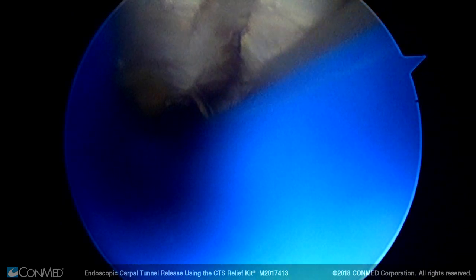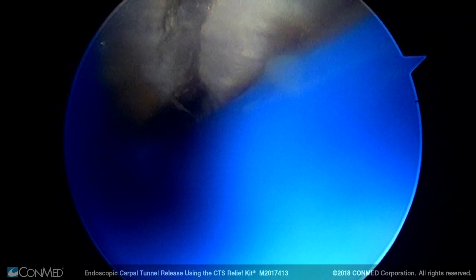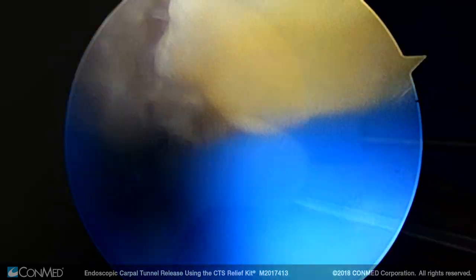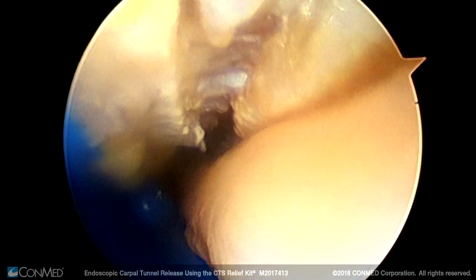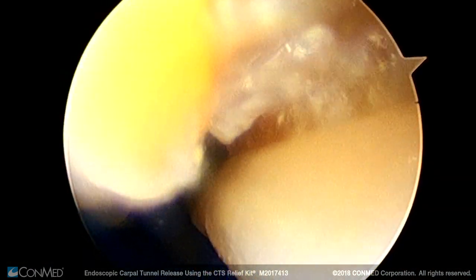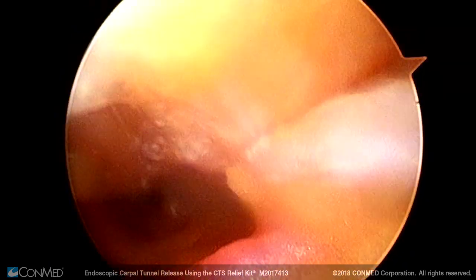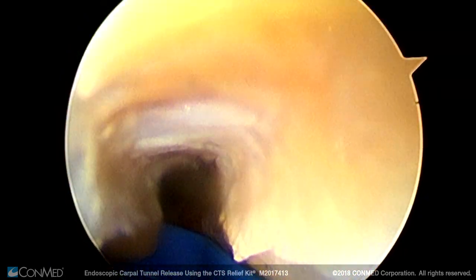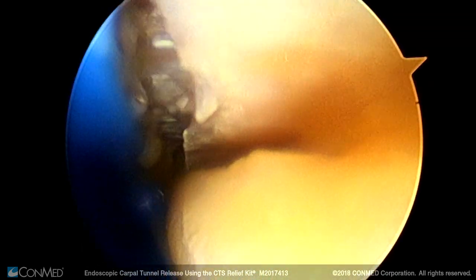Here now we can see the transverse carpal ligament released — it's been released from down here all the way up. I'm rotating the guide and we can clearly see the median nerve coming into view. You can see the guide protected our median nerve and we just completely released the carpal tunnel and the transverse carpal ligament. The median nerve is to our right, and there it is coming into view.